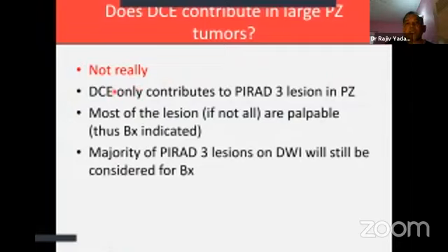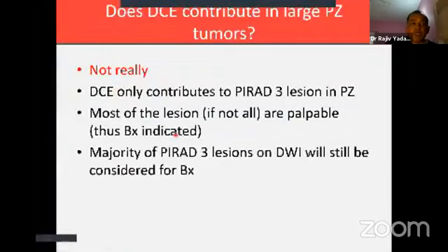A non-contrast MRI not only takes shorter time, but it is easier to schedule the MRI. It takes less time. You know, when we are ordering a multiparametric MRI without a specific instruction to the radiologist, they have to keep double the time of the MRI scanner compared to when they do a spine or maybe a brain. It takes at least double the time, and maybe sometimes more, because it takes so much time in doing all the sequences.